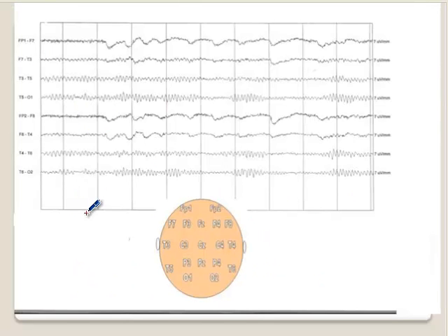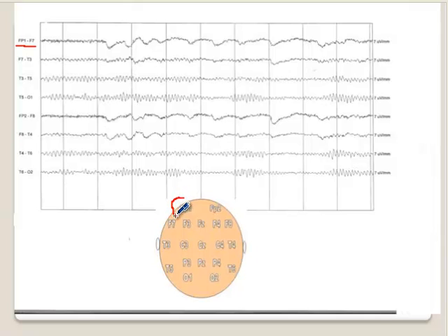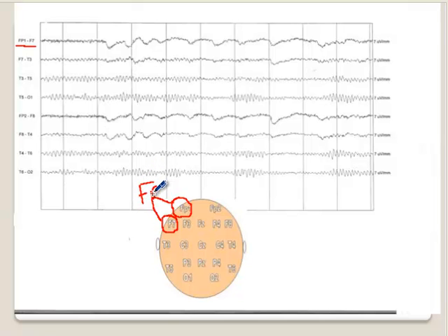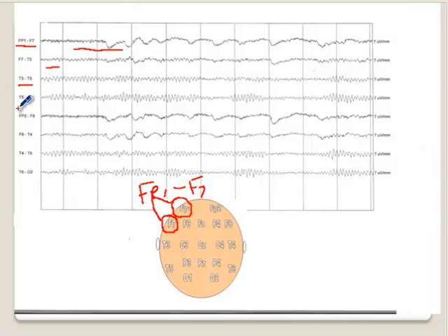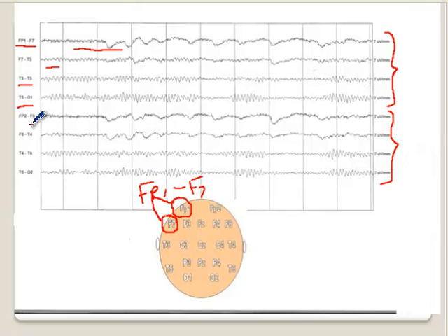So let's move on. This is a normal EEG. You see here Fp1 and F7, meaning this electrode Fp1 and this electrode F7 are represented here — the potential difference between Fp1 and F7 is shown in this channel. Likewise, the potential difference between F7 and T3 is shown here, then T3–T5, T5–O1. Since these are all odd numbers, the upper four channels are recording from the left side, and the next four channels, which all end with even numbers, are recording from the right side of the brain.